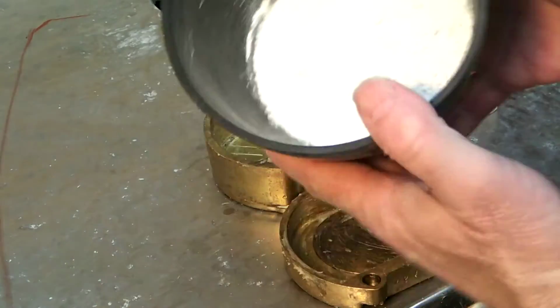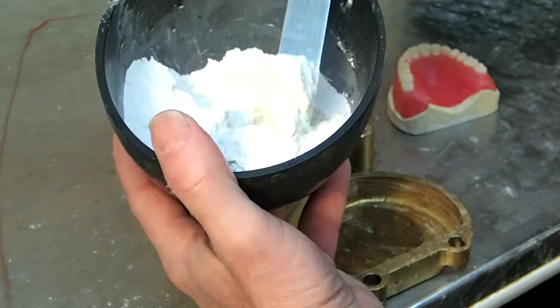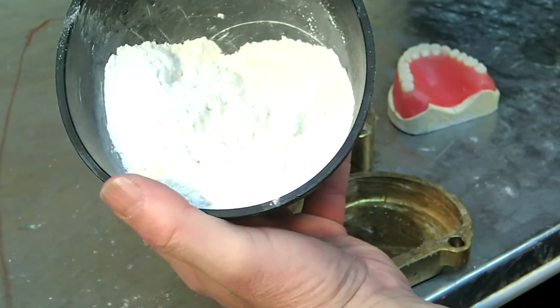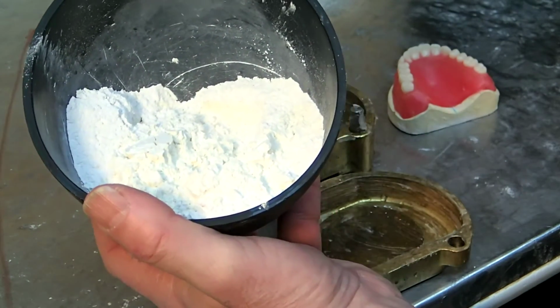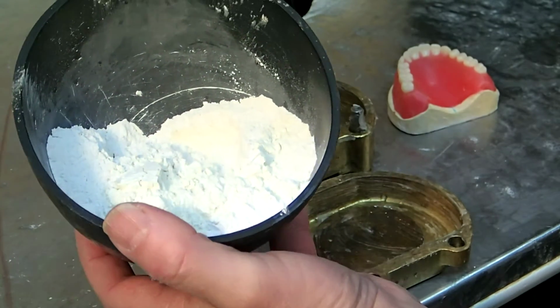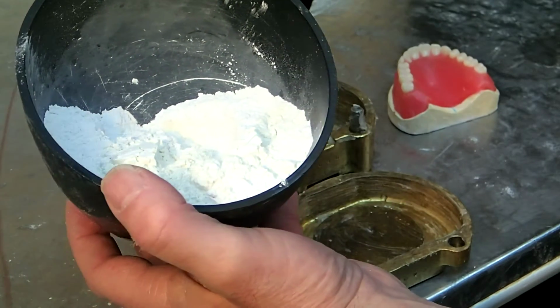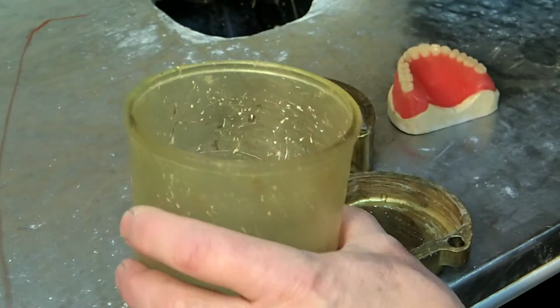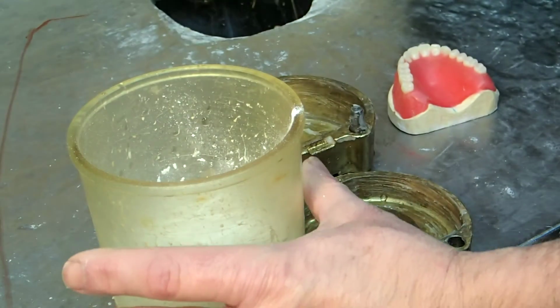To do the flasking, I'm going to need a mix of stone and plaster. So this is half stone, half plaster. We call this half and half. We do that because stone is too hard and takes too long to set. Plaster is too soft and sets pretty quickly. So when we mix the two of them together, we get a material which just works beautifully for our flasking. This is half a cup of stone with half a cup of plaster. That's enough to do one flasking.